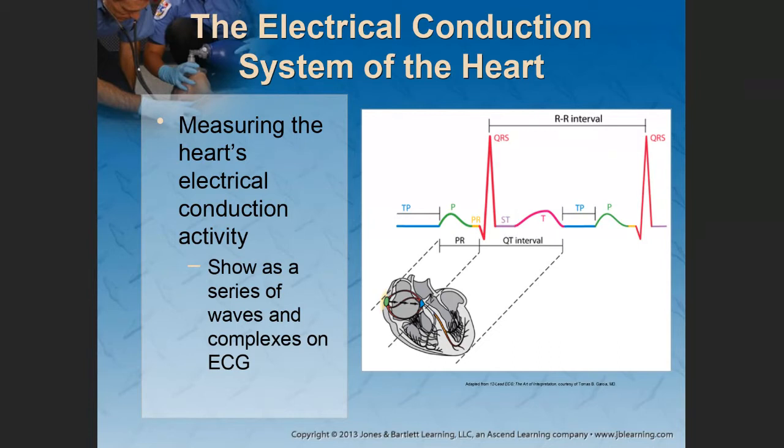Now, after the ST segment, you have the T wave. The T wave represents when the ventricle repolarizes or recharges.